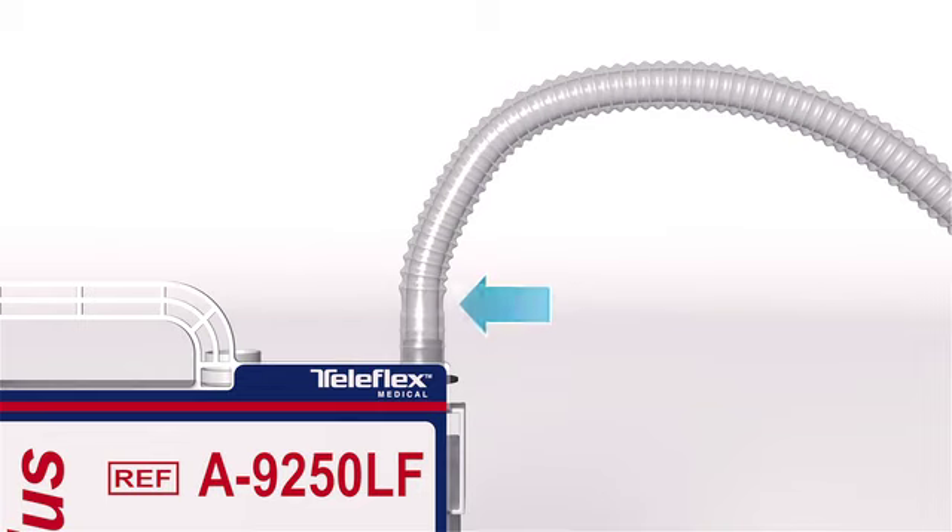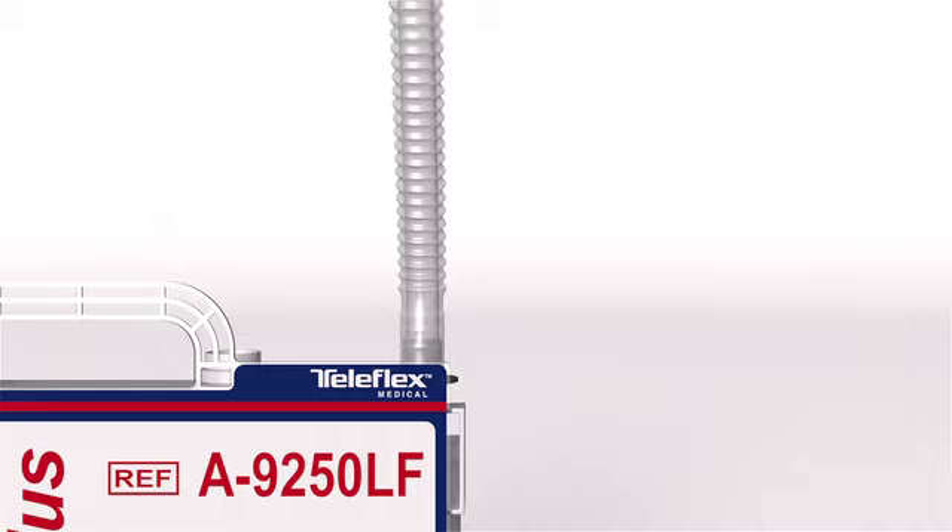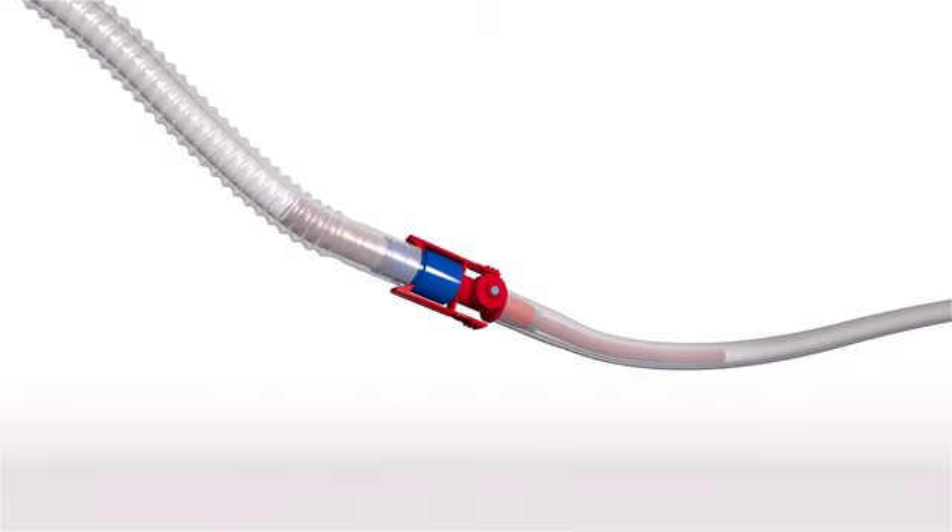At the junction where the six-foot patient tube connects to the collection chamber, anti-kink tubing is incorporated to eliminate any unnecessary metal springs or other materials being in the critical blood flow pathway. Just beyond the anti-kink tubing is a pair of red and blue locking connectors, which allow for quick disconnection and reconnection to a new chest drainage unit when necessary. A needleless sampling port is located at the junction, allowing specimens of patient drainage to be taken whenever needed. Use only a standard luer lock syringe to withdraw samples from the autotransfusion connector. No needle is required.